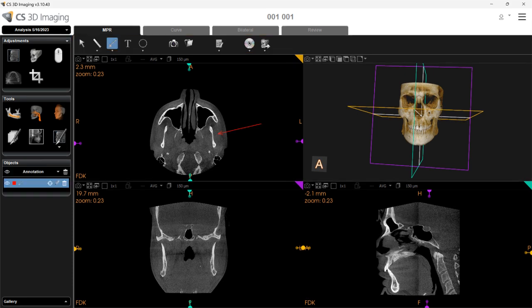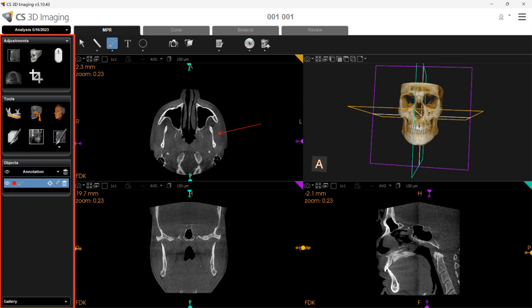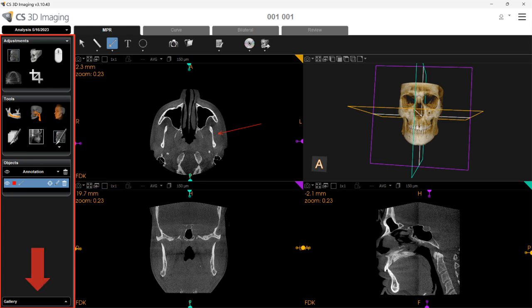On the left side of the window, the Toolbox is available. The tools shown depend on the workspace tab you have selected and the preferences you have configured. The Toolbox contains the Adjustments pane, where a range of display adjustment tools are available. The Tools pane displays available tools dependent on the tab you are viewing. The Objects pane displays all tools that have been used in the Tools pane or in the horizontal toolbar, such as annotations or nerve canal tracings. The Gallery displays thumbnail images of screenshots, snapshot images, and cross-section slice series.